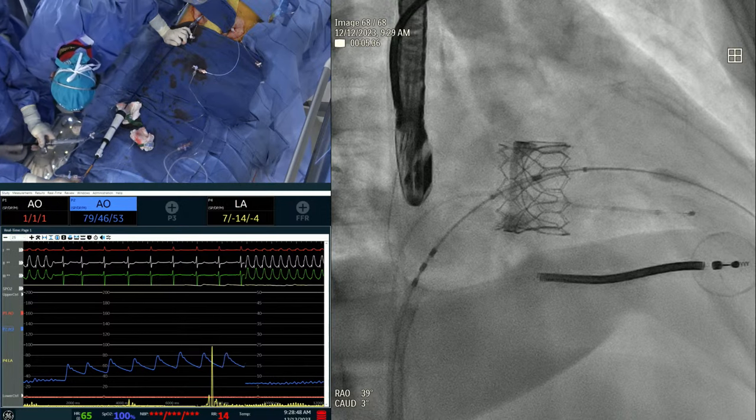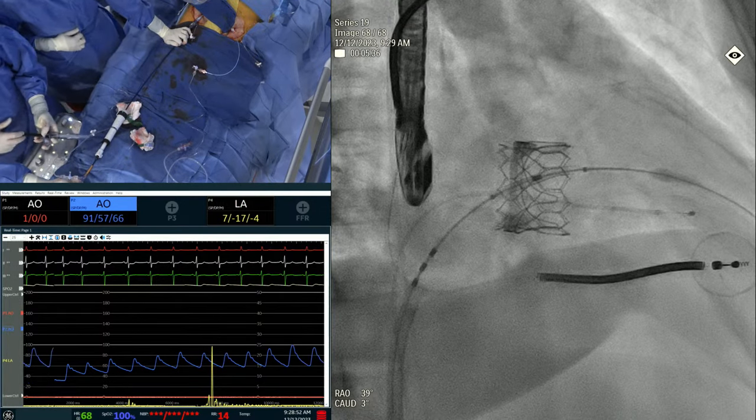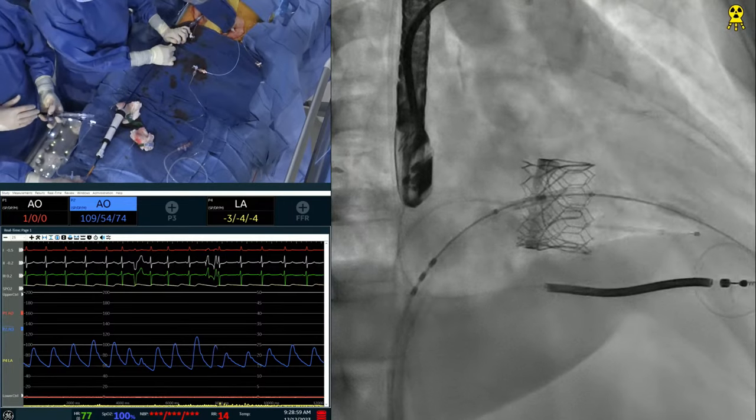Let's do one more. Did we fluoroseal? I don't know. Probably not. Let's do one more. Okay. Amazing. Blood pressure's come up. Recovered good. Yeah. Do one more. Okay, 180. Make sure you go full.